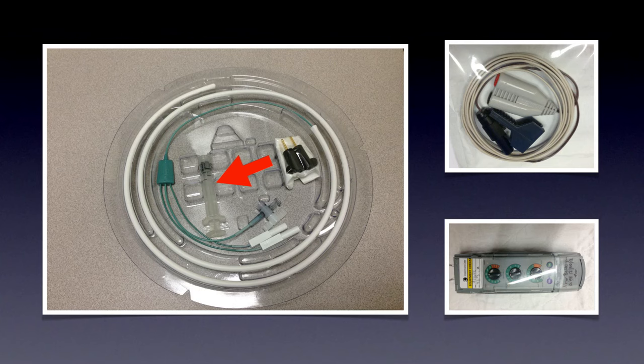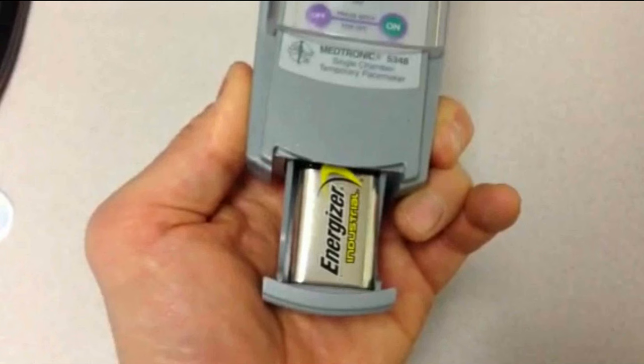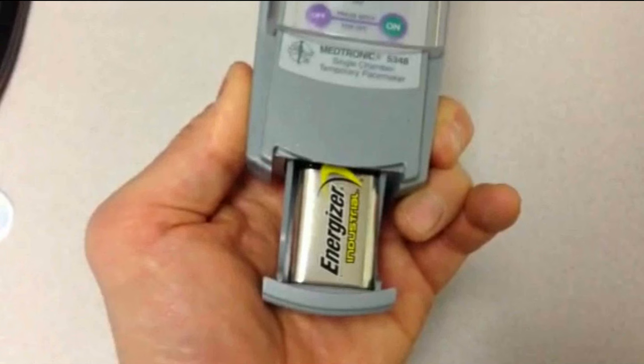The battery goes in the bottom of your pacing generator — always put in a fresh battery. To open the battery door, you must press two buttons simultaneously on the side of the generator, which slides the door out to reveal the nine-volt battery. Everything on the temporary transvenous pacing generator requires a deliberate action, because you don't want anything accidentally changing the rhythm, rate, or disconnecting the device.